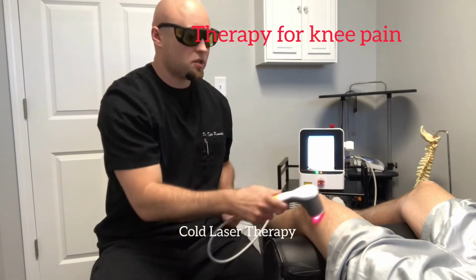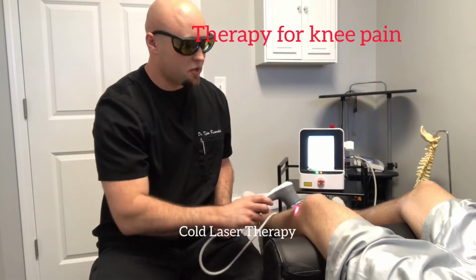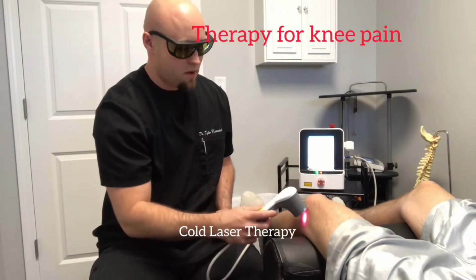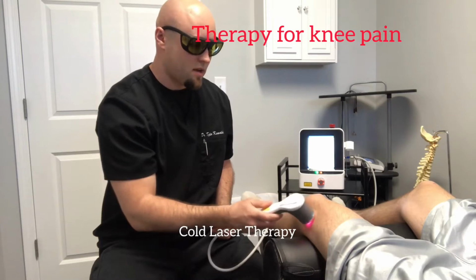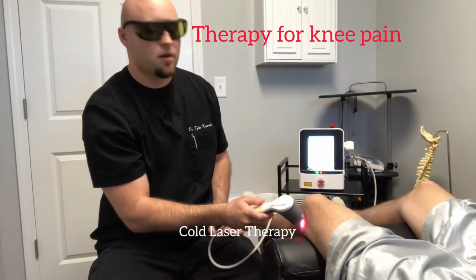And what the patient's going to be feeling is just kind of a gentle warm heat. Feels usually really good. We got to keep the laser moving around, otherwise it will get a little bit too hot. That's why we got to manually move it around. And we usually perform this about 5-10 minutes at a time, usually around 10 minutes. And a lot of times we'll use it for ankle sprains as well.